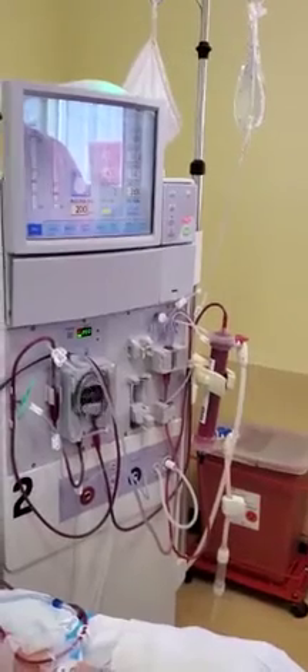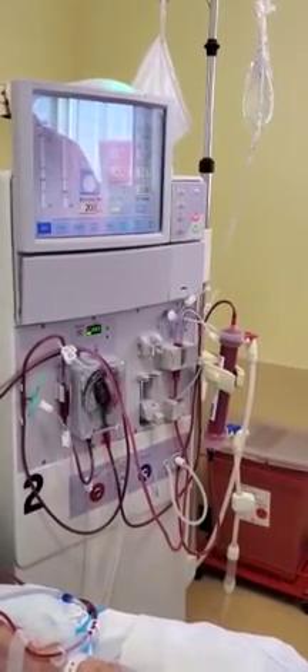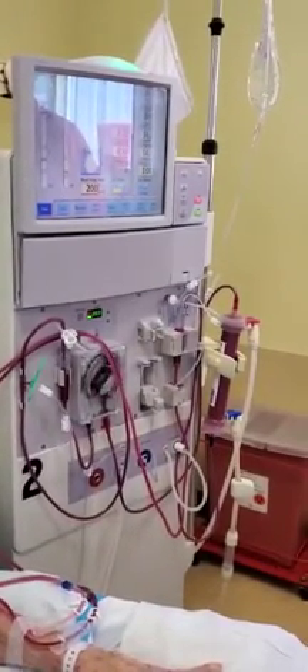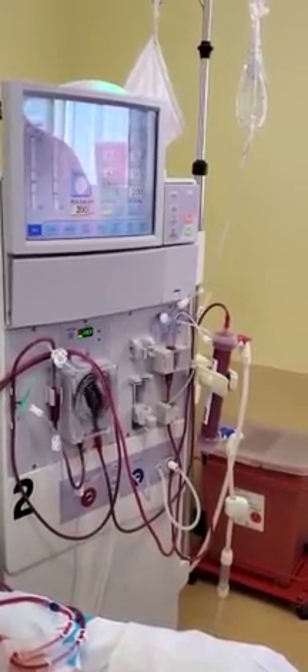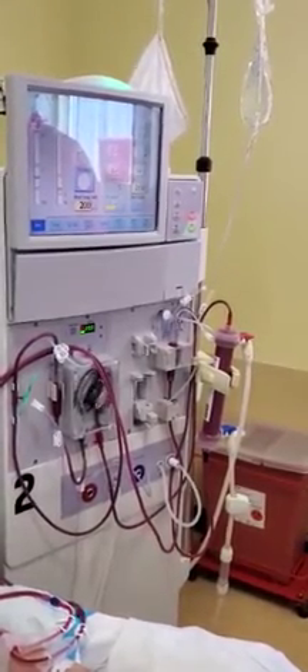As the patient starts, an initial blood pressure will be taken, and that's happening now. At the same time, the technician is also looking at the venous and arterial pressures with the blood flow rate at 200 ml per minute.